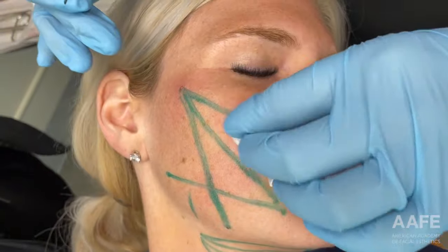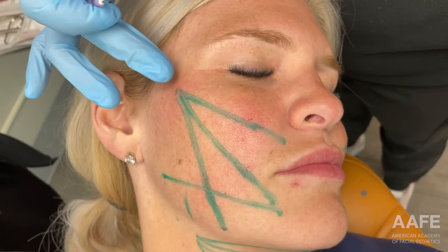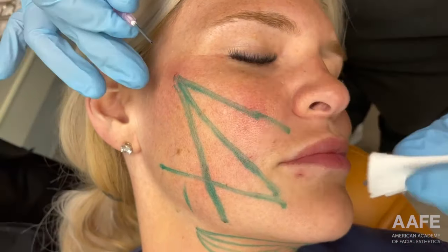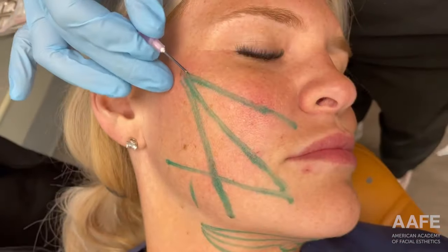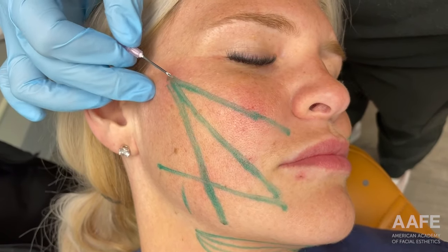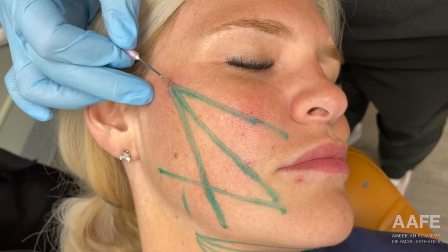I have just used lidocaine to numb our entry points, so that way when I go in with our introducer needle, she doesn't really feel much of anything. She might feel a little bit of pressure, but I'm now going to use my 18-gauge needle to create our entry points for our vectors.